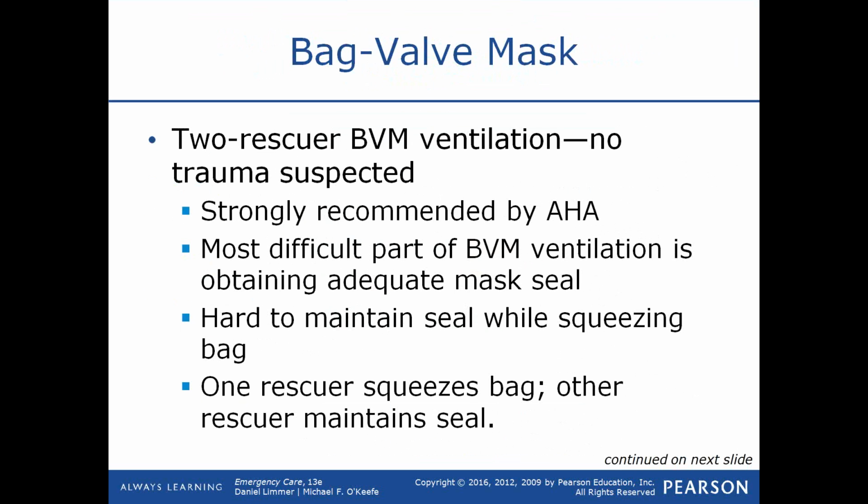Two-rescuer bag valve mask is recommended by the American Heart Association if you're going to give ventilations, because the most difficult part of bag mask ventilations is maintaining a good seal with the mask. Now, when you practice this in the lab, you may be able to do that once or twice with a mannequin, but that's not a person.